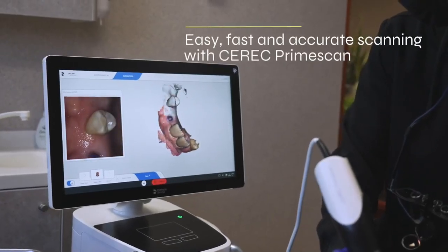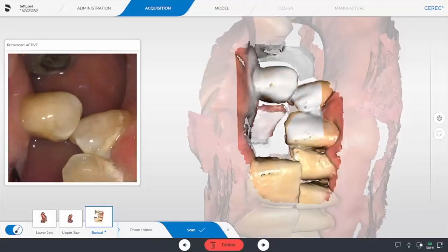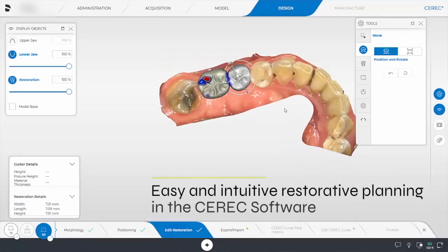They'll come back to the operatory and either myself or an assistant will go ahead and scan that patient's arch with the PrimeScan. So once we have all the CEREC scans completed with the PrimeScan, we'll go ahead and design the crown.